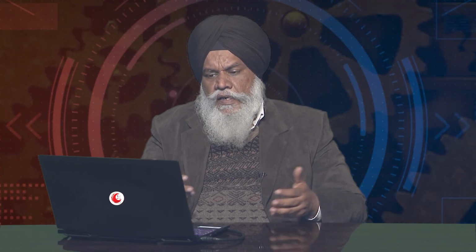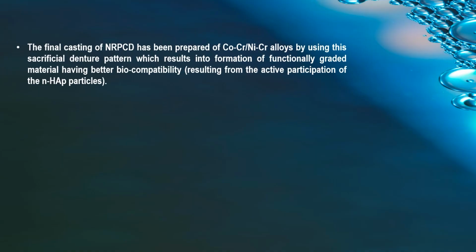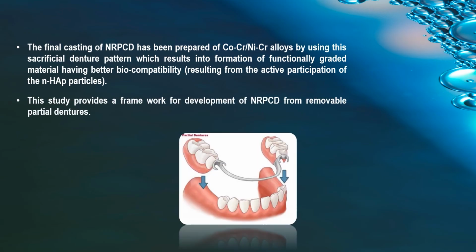That is one of the reasons we selected this composition and tried to prepare our own filament for this case. And the final castings were prepared with cobalt chromium and nickel chromium alloys as per the commercial standards, right?